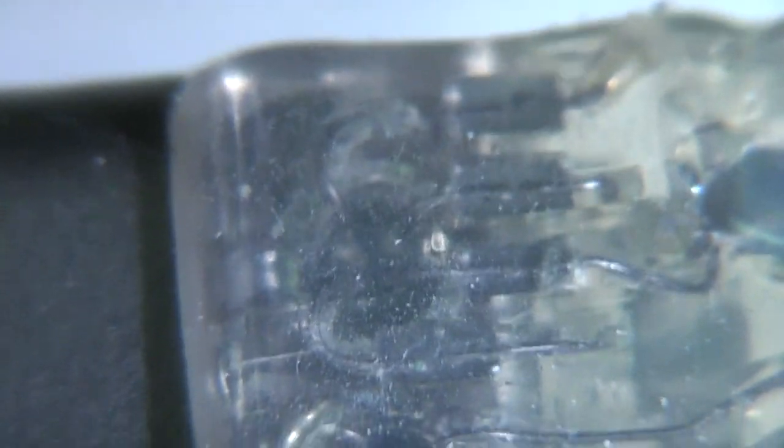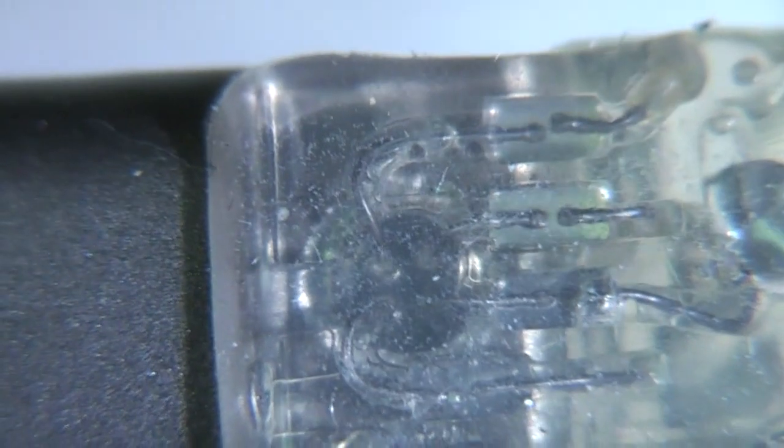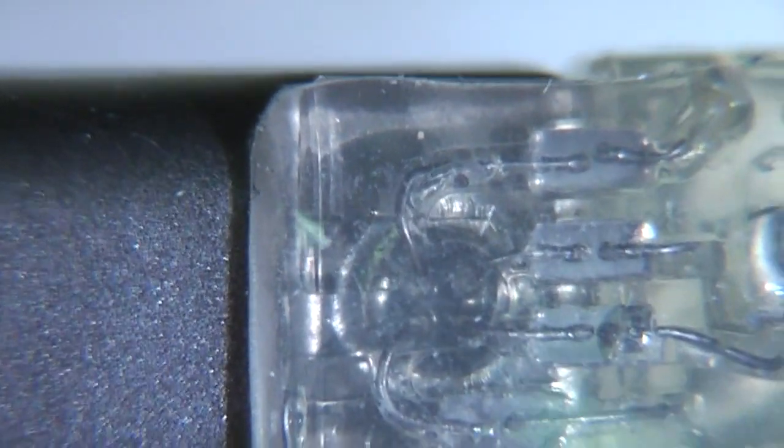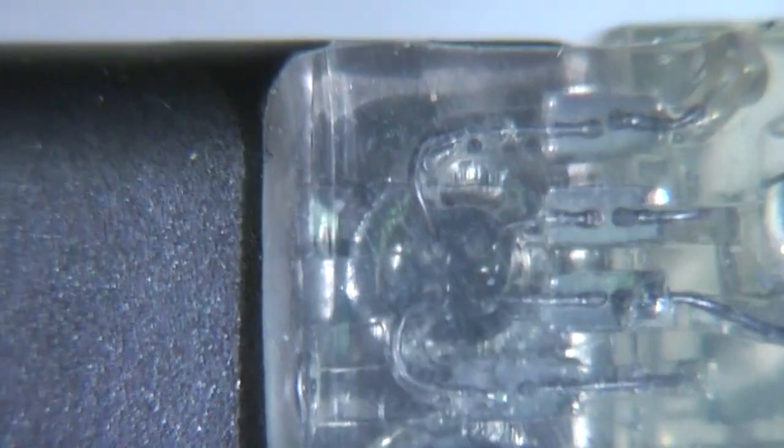This top piece is for connecting the various electrodes. This is made of a clear plastic, and it looks like the top piece and the defibrillator case are made in two things, and then there's these welds. So I'm guessing each part has wires coming out of it, then they're welded together, probably with an ultrasonic weld or maybe a resistance weld onto these panels. You can see these terminals.